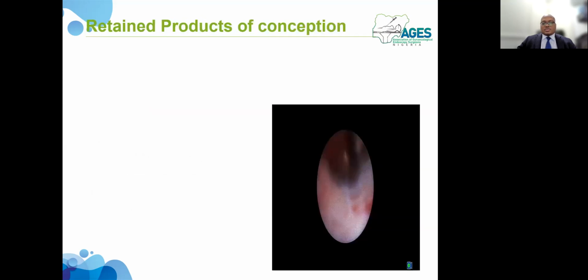For retained product of conception, this short video is not removal of retained product, but it's used to demonstrate how the skill and principle can be applied in removing retained product of conception.